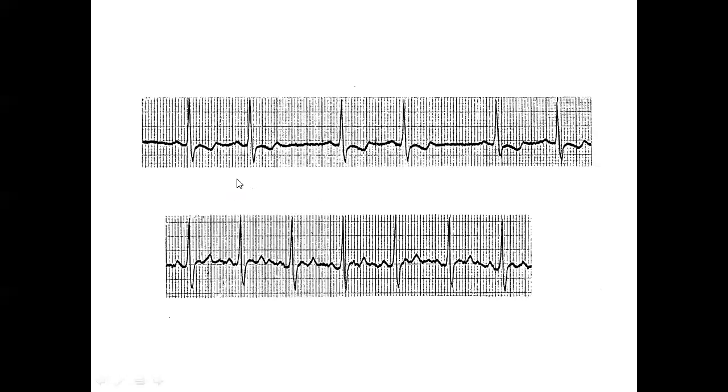Well, what is the P? There's no blocked P though. This is a T. This is a T. Well, judging from what happened the next moment, this lines up and this lines up with this. So this is a 1-to-1 conduction, 3-to-2 SA block. Sinus node dysfunction, yeah.